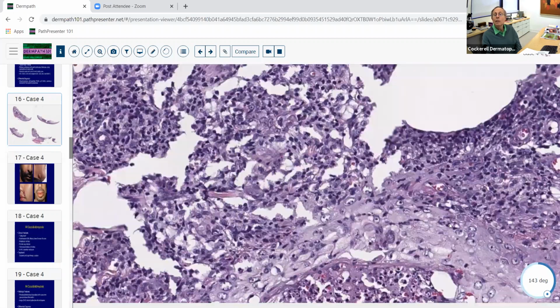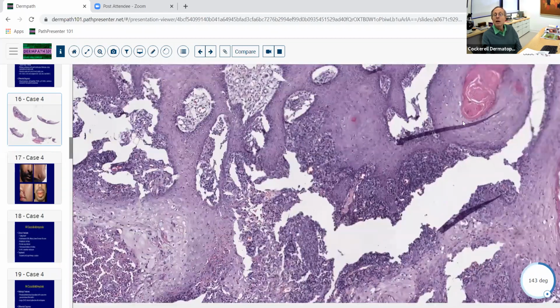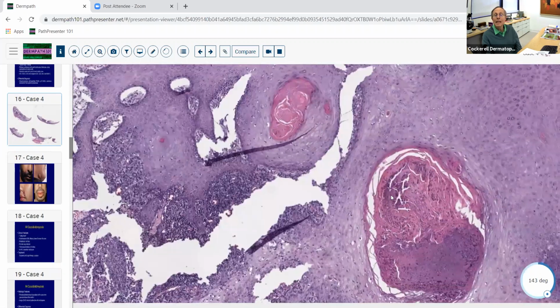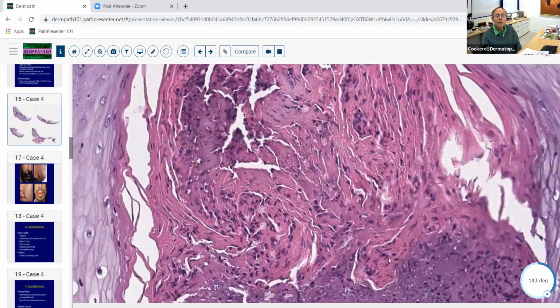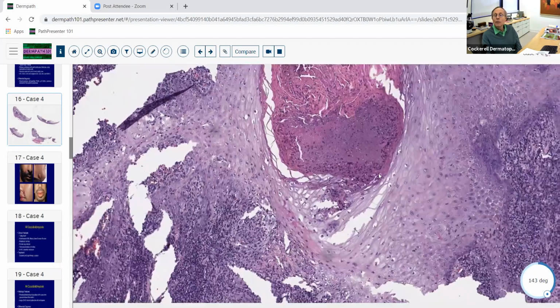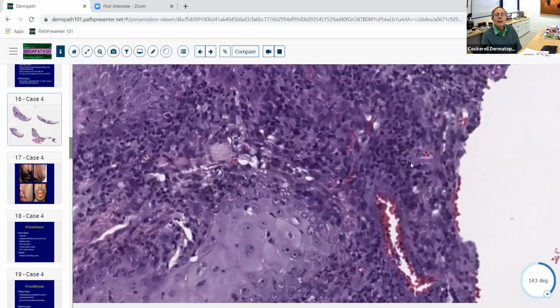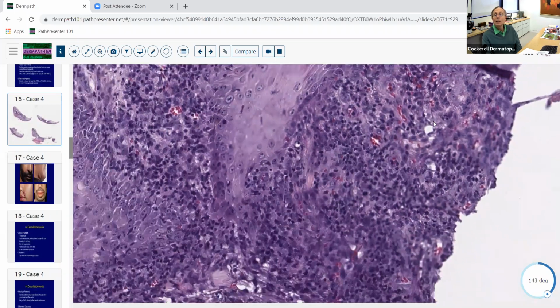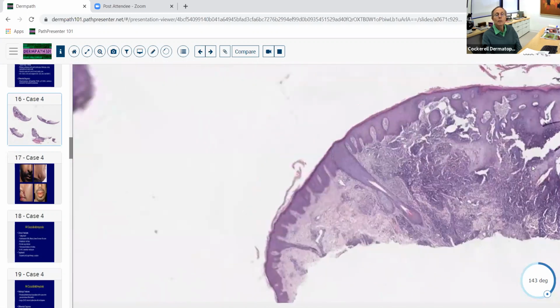If I can find an organism, the best place to look is either in the abscesses, often in the epidermis, because these organisms get transepidermally eliminated. So if you look up in an area like this, you might be lucky enough to find some. Don't see any so far. And then you want to look if you can see multinucleated histiocytes. That's also helpful. But I can tell you that what we actually did find here, I don't know which field it's in, maybe you look at one of these others, you might be able to see one.